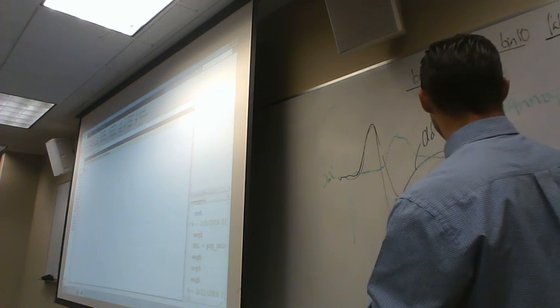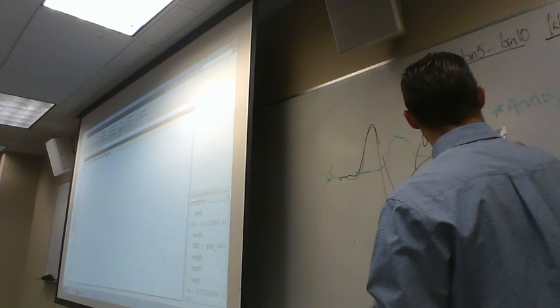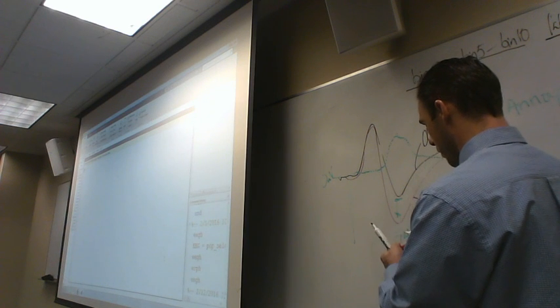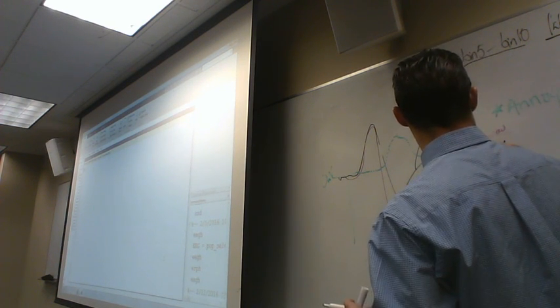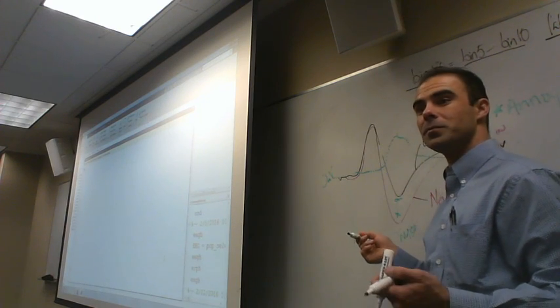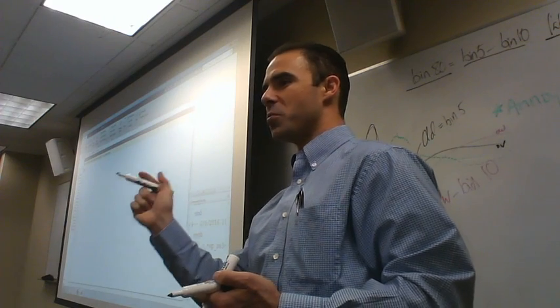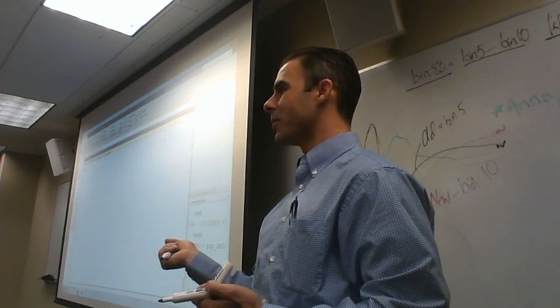But here we have new greater than old, and so if we continue our green line out for our difference wave, it would start here and come a little bit less negative. When I was learning this stuff, that graphical representation really dialed in what a difference wave represents. You guys follow?